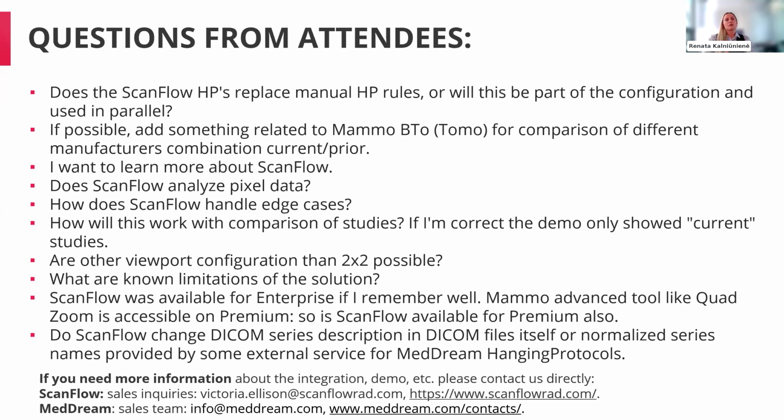Okay, thank you. Next question. ScanFlow was available for enterprise, if I remember well. Mammo advanced tools like Quad Zoom are accessible on premium. So is ScanFlow available for premium also? It's related to MedDream packages: enterprise, premium, and light. So Mars, maybe you could add on this, or we should later.